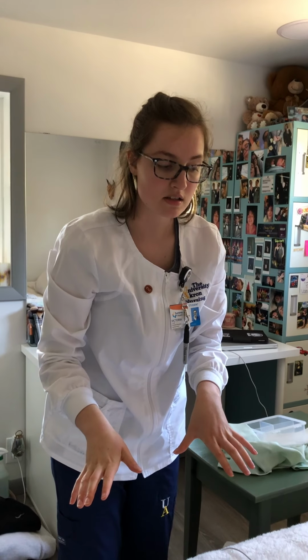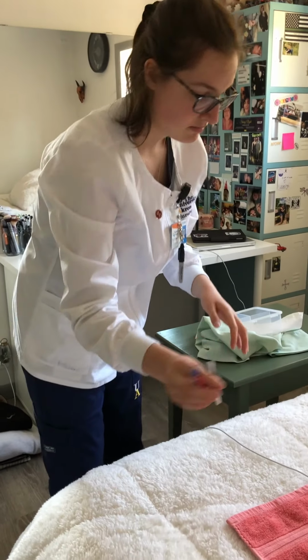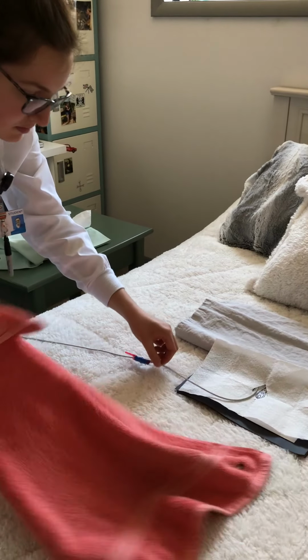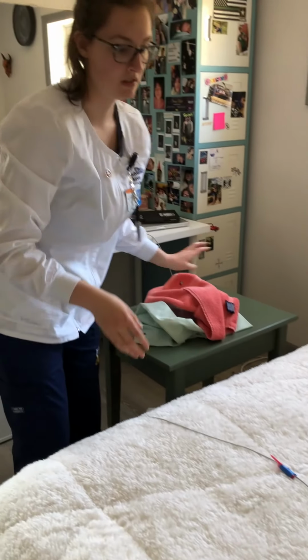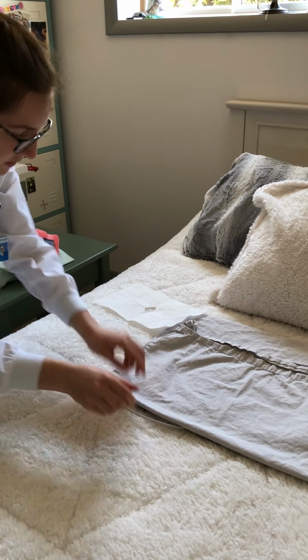I probably should have kept my gloves on until I cleaned up the procedure, but throw everything away. But let's pretend that I kept my gloves on. And then I'm going to drape the patient, okay?